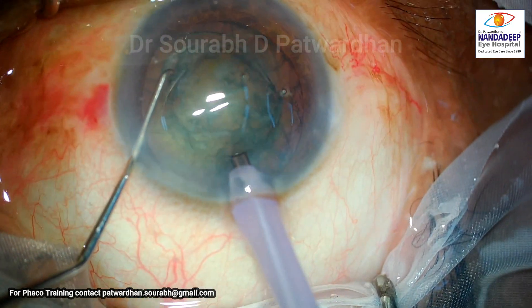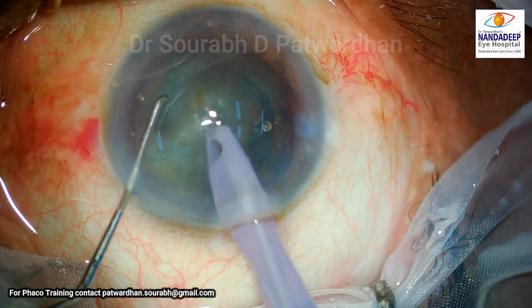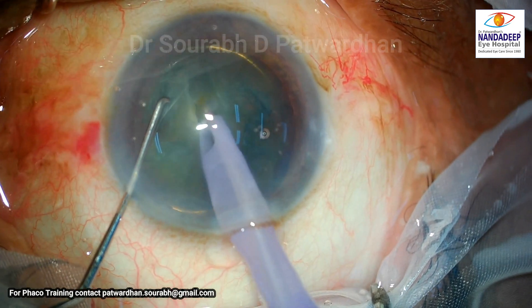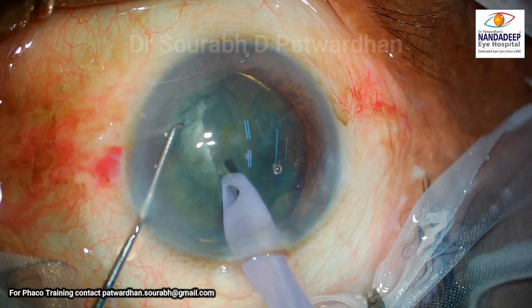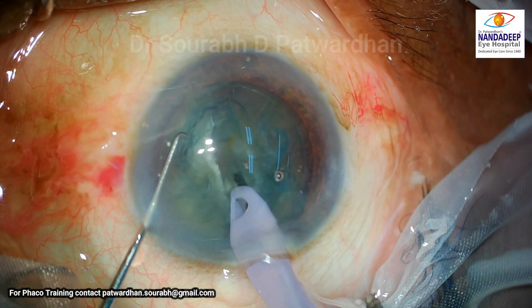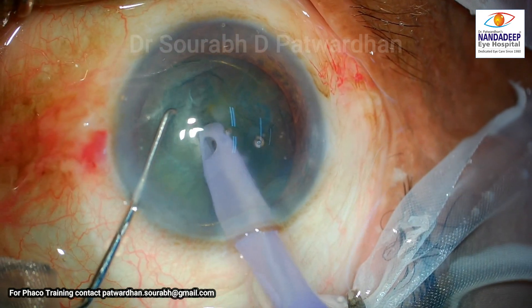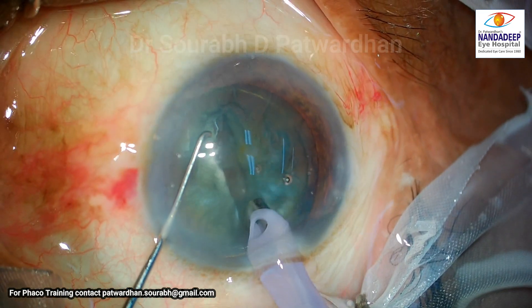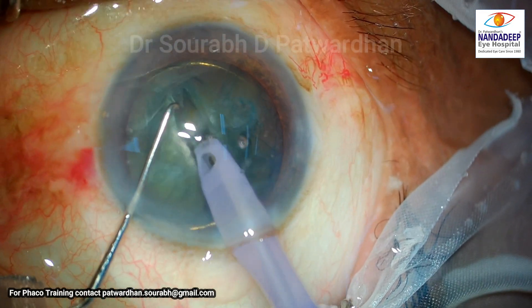The surgeon starts with continuous irrigation on and trenching has started — the trench and divide technique is being used here. The trenching looks pretty good, with not much movement of the nucleus, which is good. You should not be pushing the nucleus; it happens more commonly with harder grade cataracts. This is a grade one to two cataract, so it is going on nicely.